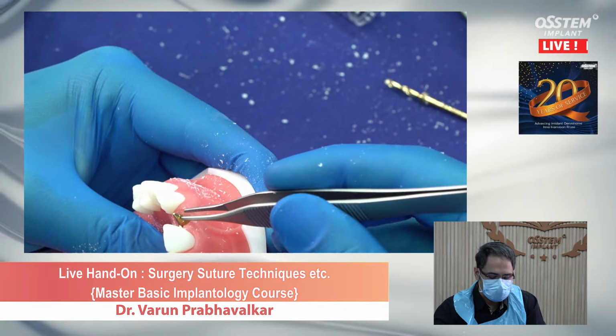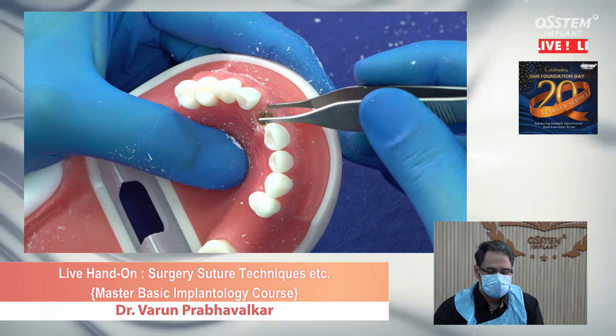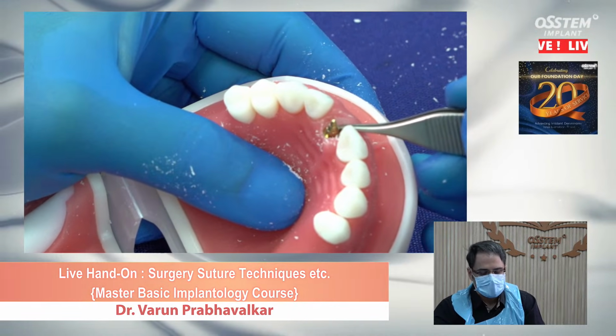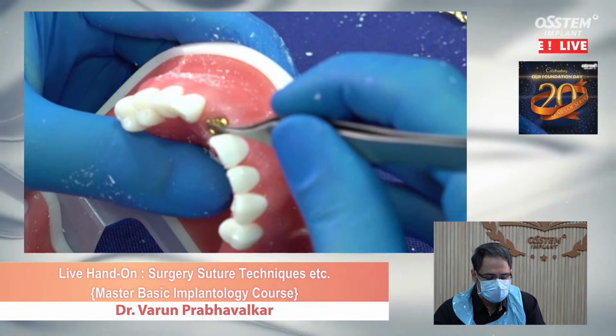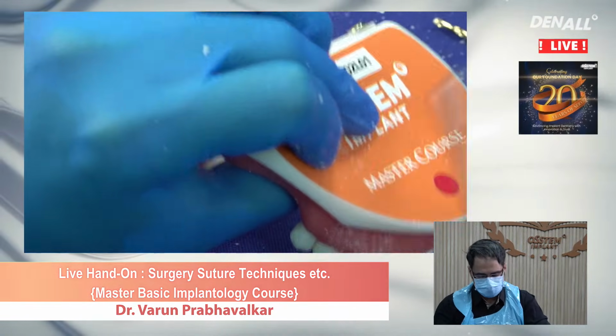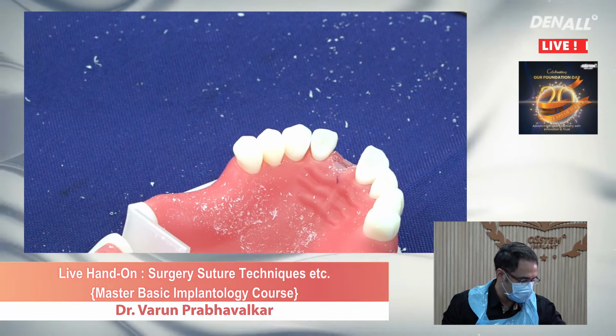But in all, this is going to be our position of the implant, which I'm completely okay with. Okay? There you go. Now, I'm going to take out the paralleling pin, and we are going to proceed with the rest of the osteotomy.